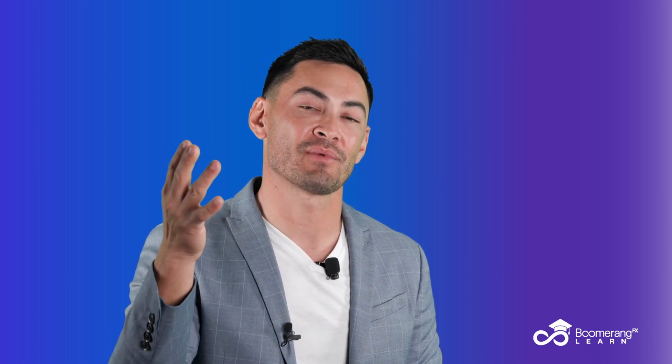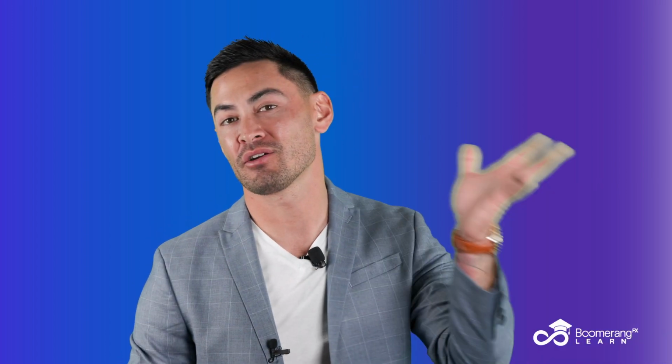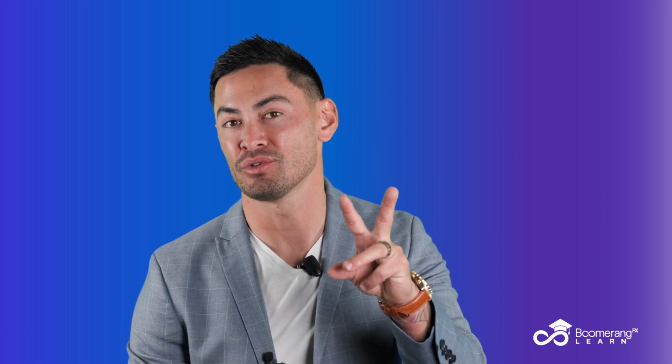Here's an example. If I'm doing FaceTite to the jawline, let's say I get to my temperature on my right side. And that temperature that I set was, call it 40 degrees. Okay, so I set my external temp at 40 degrees. I got to my temperature and it took me 3.5 kilojoules to get to the temperature. And then I go to the left side, same 40 degrees, and I get there in 2 kilojoules.